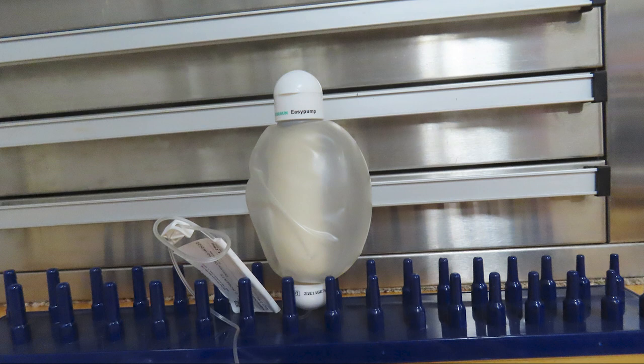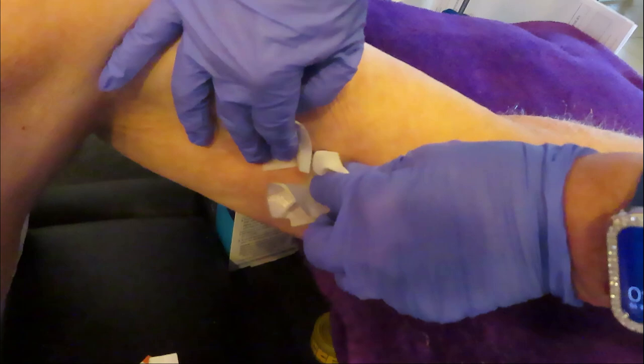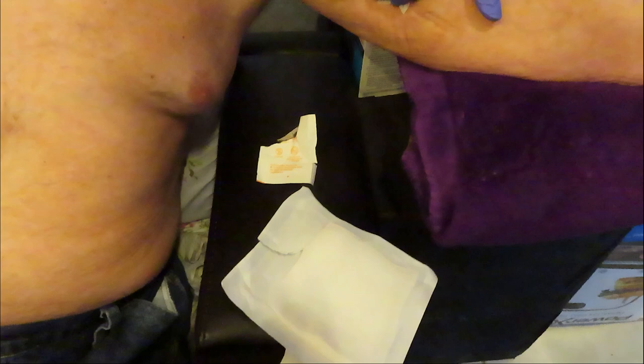So now the PICC line is being removed. Well, that's the bandage off. Okay. And now she's going to supposedly pull it out slowly. Jeez. It's out. Too late. There it is. Well, that's pretty much all to it. Okay. So you wonder if you can't get anything through it. Yeah. That's all it is.